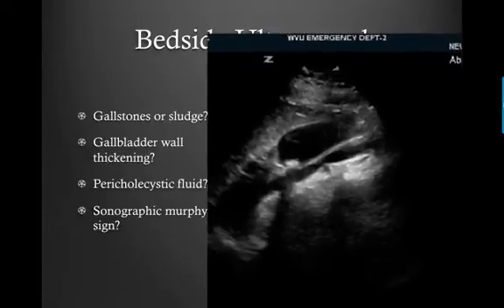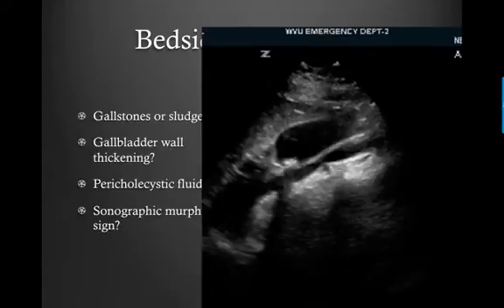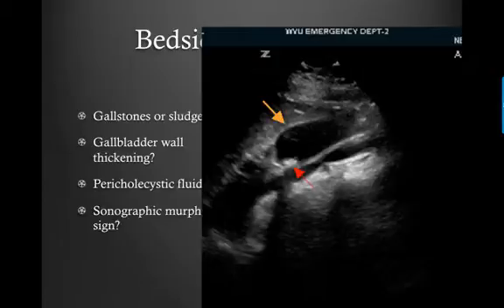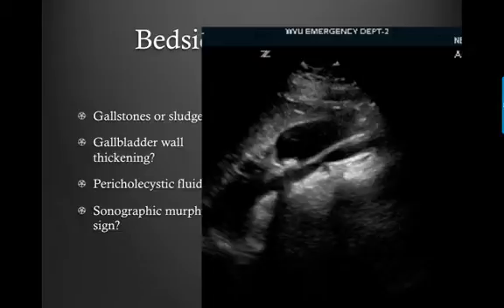Looking more closely at this ultrasound image, we can see stones present. The wall is nice and thin — it's going to measure less than 3 millimeters. Anything greater than 3 millimeters is considered a thickened wall. You always want to measure the anterior wall. There's no pericholecystic fluid, and of course from the image I can't tell you whether or not there's a sonographic Murphy sign.